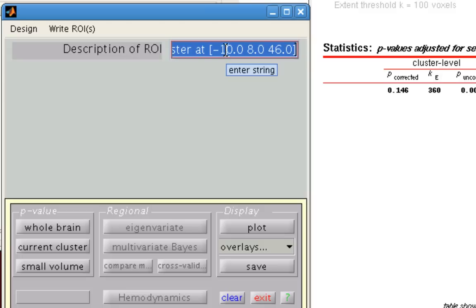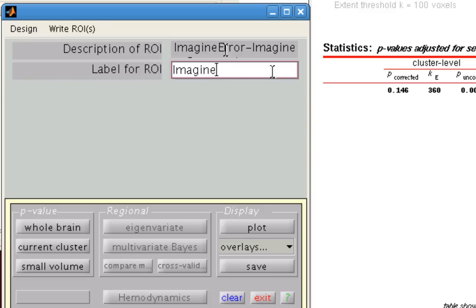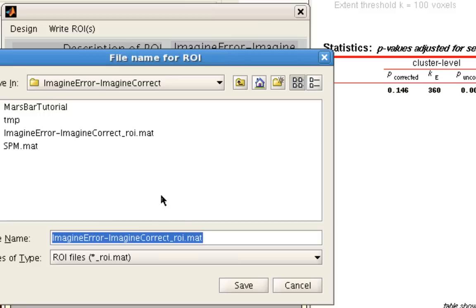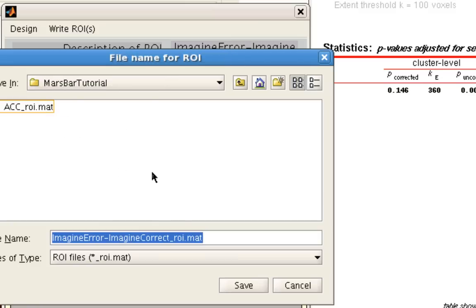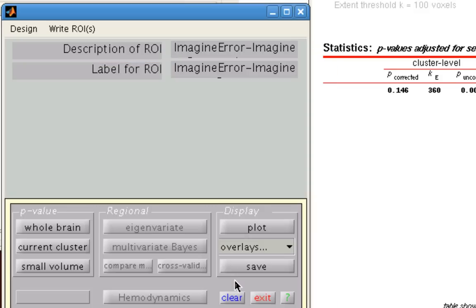Description of ROI, again, defaults usually fine. That's usually for header information. And I'm going to call this ImagineError-ImagineCorrect. And you can save it within the directory that you want to do your analysis in. So here, I'm going to save it in that directory.